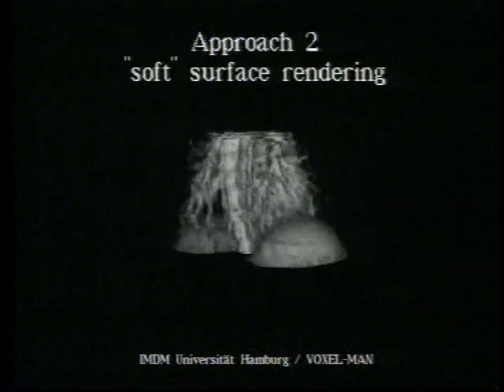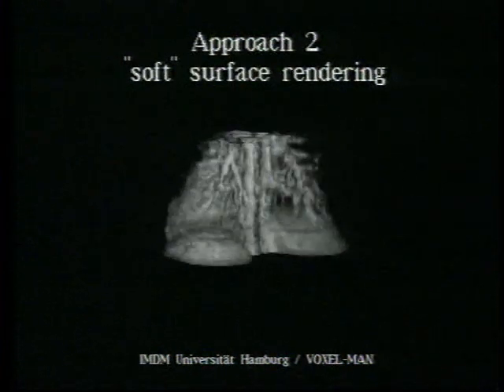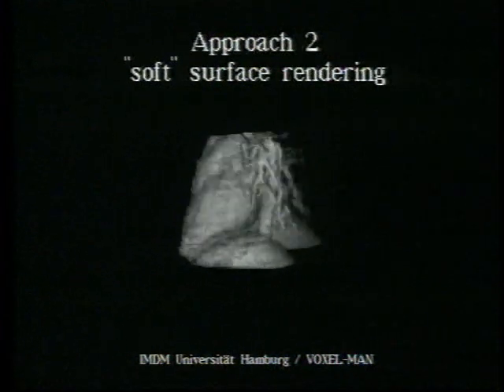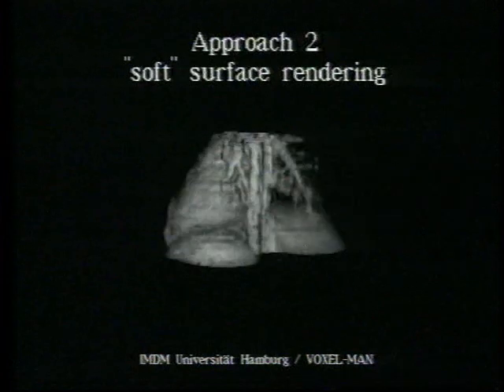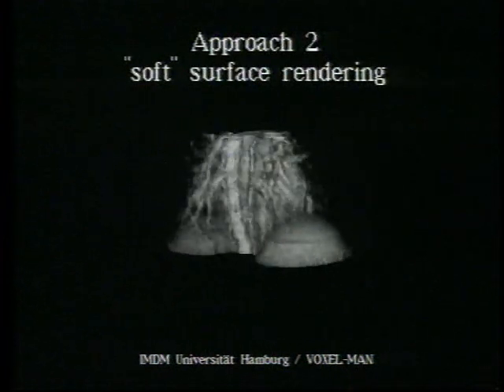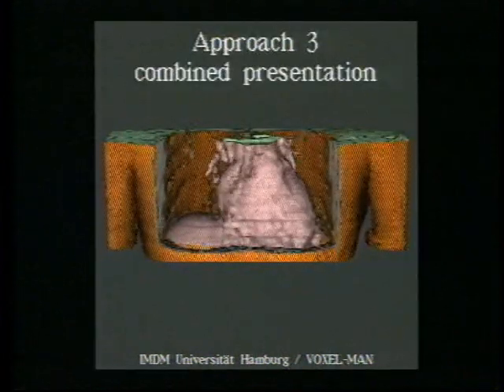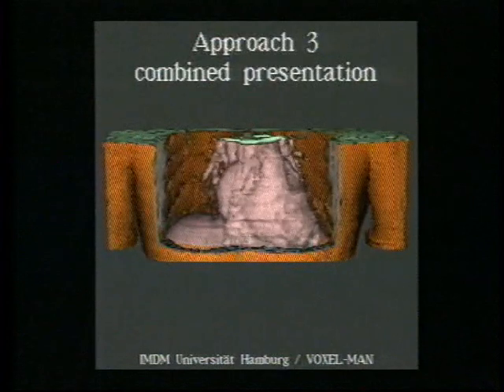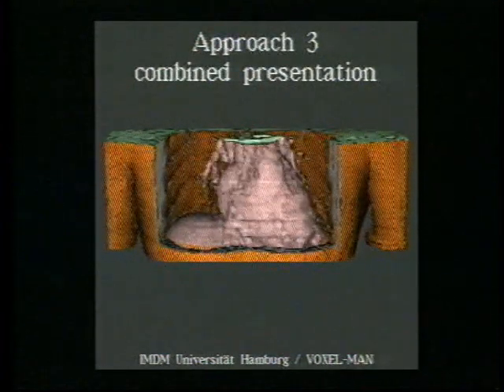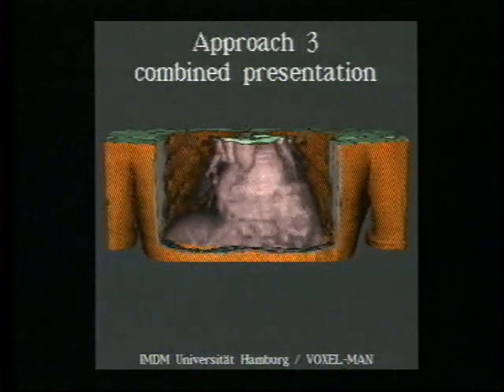Volume rendering gave these results. The beating heart, pulmonary vessels, and a diaphragm could be inspected from all directions. A combined mode — volume rendering for the heart and surface rendering for the exterior — seemed to be the best. Changing transparency made hepatic vessels visible.